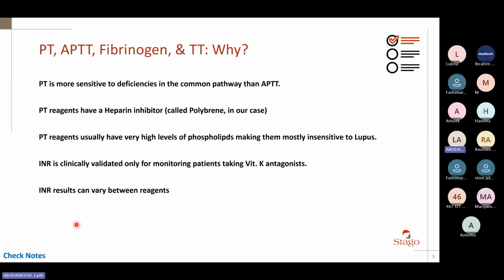But you might tell me, okay, but we use INR to report normal results. Or we can say, okay, if the patient has less than 1.1 or 1.0 INR, they are normal. CLSI recognizes that some doctors or some physicians do that. They say you can do it, but if you can avoid it, it's good. But they don't say that you cannot do it. Okay, so again, CLSI says, no problem, you can use it, just be careful because INR is validated just for patients on warfarin. All right, but for any other purposes, CLSI strictly says no, do not use it.